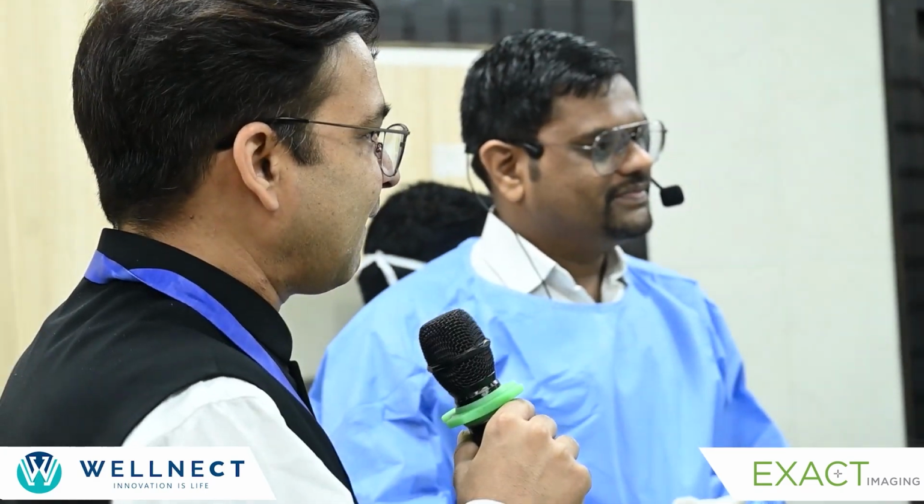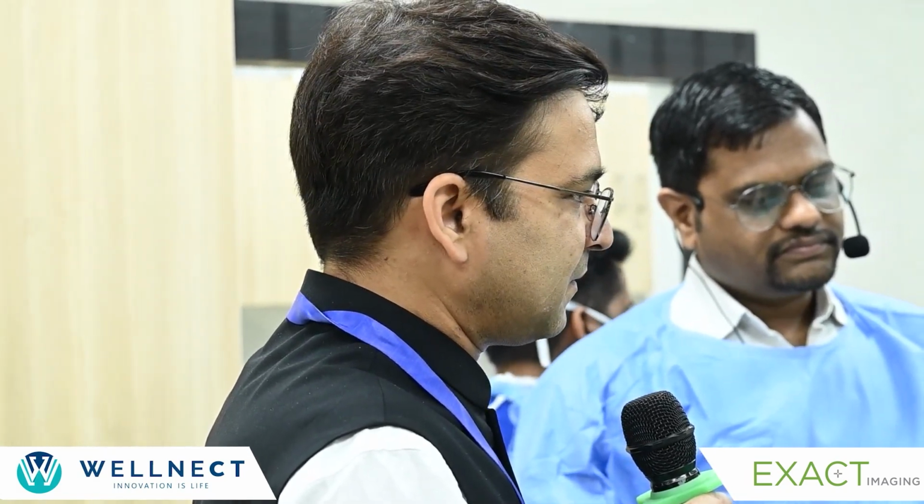I have heard your comments, there is discussion also. So the question is, what you are saying is that in places where MRI is not available, this ultrasound can be used. Yes, sir. But what about the centers where MRI is already available? In our clinical practice, we are asking for MRI before a biopsy. That is the standard practice nowadays. Yes, sir. So you have to clarify it. Is it going to replace MRI or not? It is only when MRI is not available.